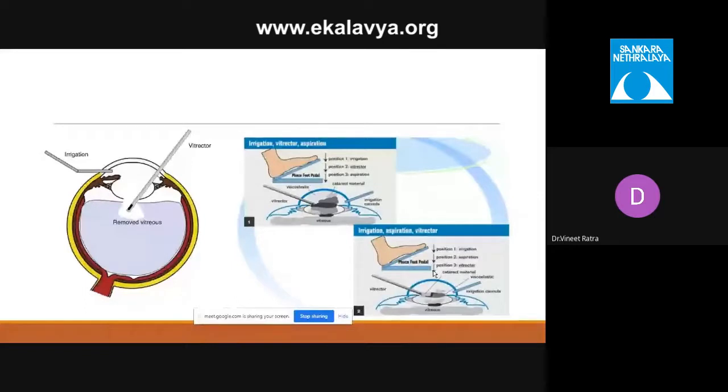You need to have your vitrectomy probe facing downwards, because what you want is that the vitreous cuts and falls back. You don't want to turn your vitrectomy probe upward and cause the vitreous to keep churning and cause a tug on it. So you hold the vitrectomy probe downwards, with a high cutting rate, low aspiration rate, and you should have viscoelastic around in your posterior capsule.